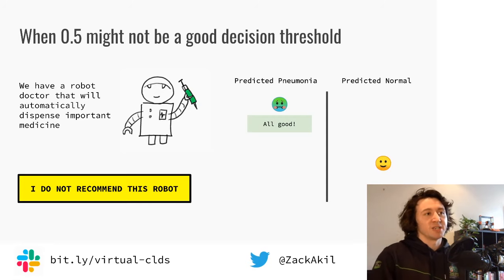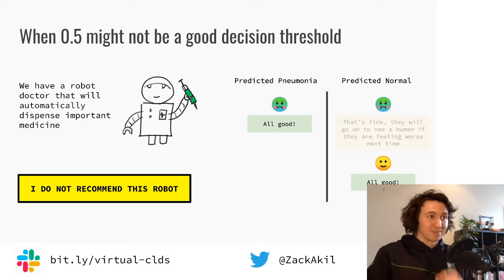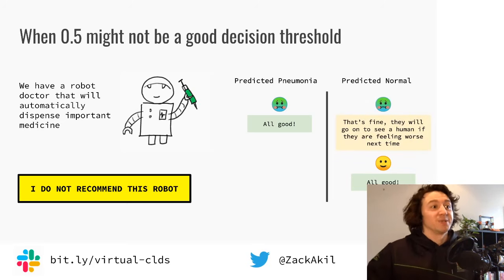Bottom right, this is the easy one. Again, we're predicting them to be normal, and they are actually normal. That's good. No considerations there. That's what our model should be doing. Now we need to think about when it's doing stuff that it shouldn't be doing.